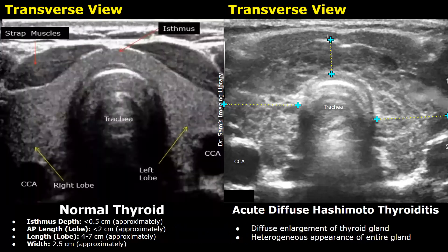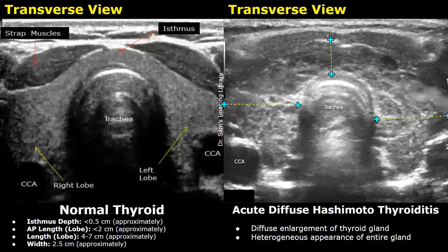We will compare the normal thyroid ultrasound image with Hashimoto's thyroiditis. This is the image of a normal thyroid in the transverse plane. The normal isthmus depth is usually less than 0.5 centimeters, the AP measurement of each lobe is usually less than 2 centimeters, the length of each lobe is between 4 to 7 centimeters, and the width is approximately 2.5 centimeters. In this next image, the patient had acute diffuse Hashimoto thyroiditis.